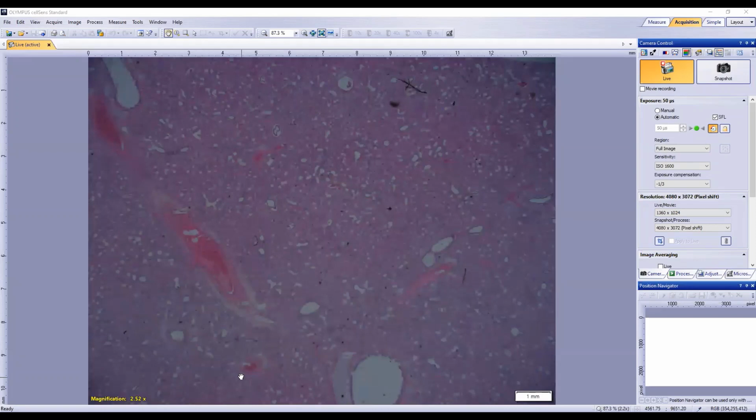A really, really important infectious cause of pneumonia in foals: Rhodococcus equi. So how is Rhodococcus going to look different from what we've seen here? I don't remember exactly, but I think like a bronchopneumonia. Yep, embolic pattern.